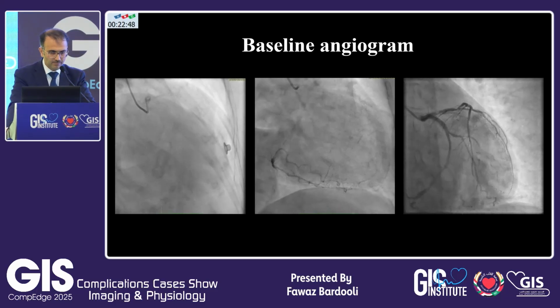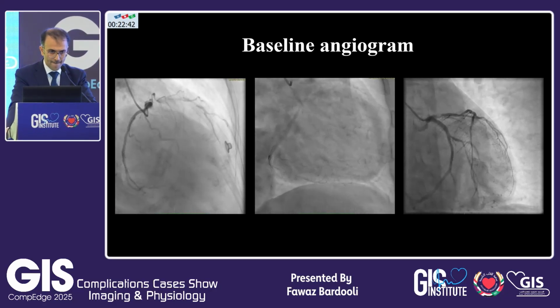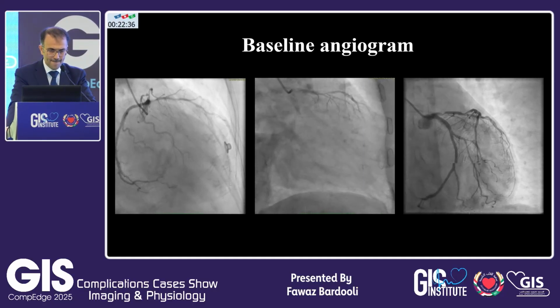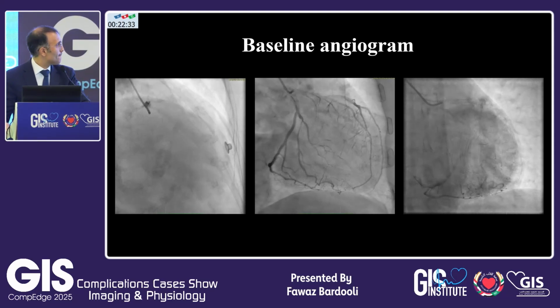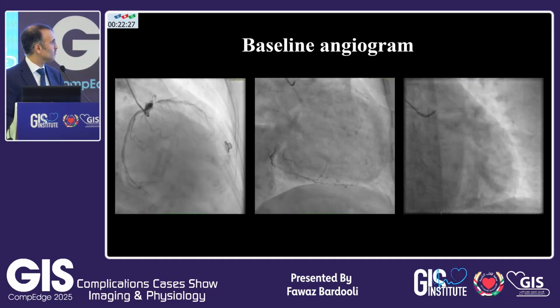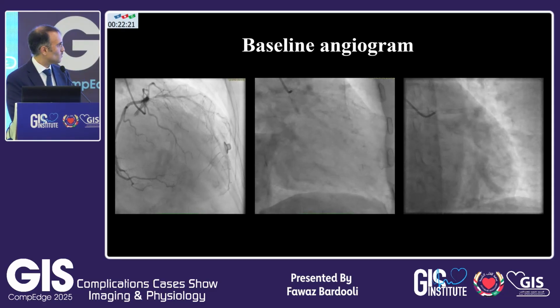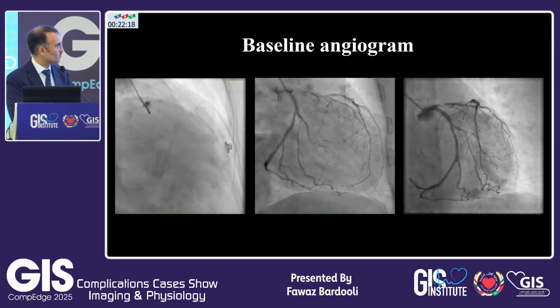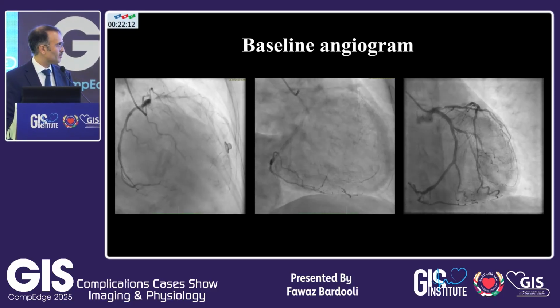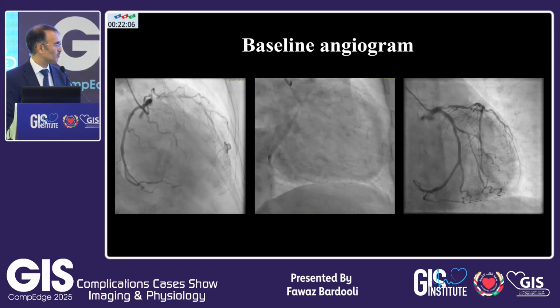Go ahead, doctor. So, first of all, this is a left coronary system injection. You have LAD severe proximal, mostly calcific stenosis. The rest of the LAD mid-segment also looks angiographically significant stenosis. These are all caudal views. And then you have the OM1 tight stenosis. And it's a left dominant system, and the PDA and the PL don't show any significant stenosis.